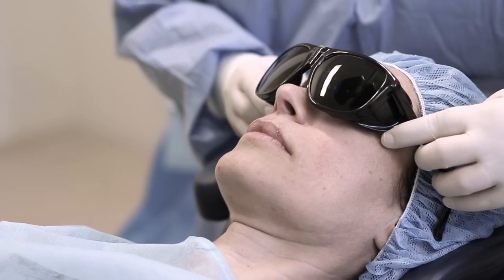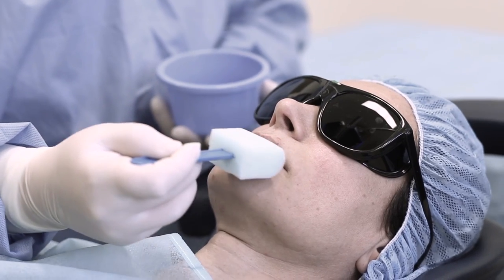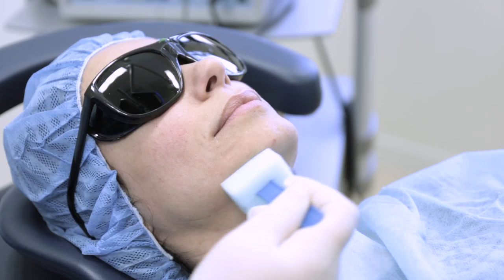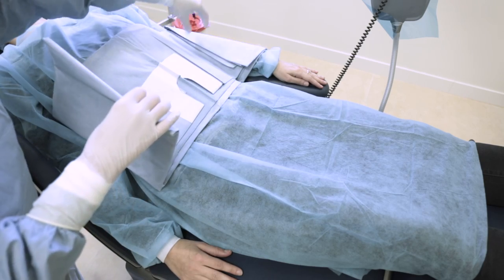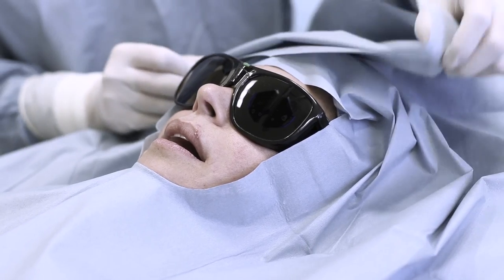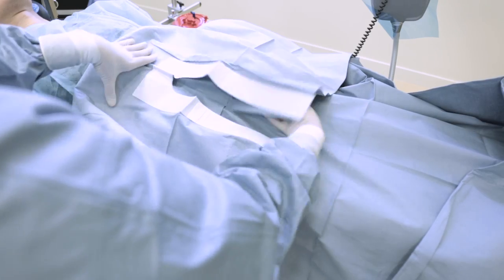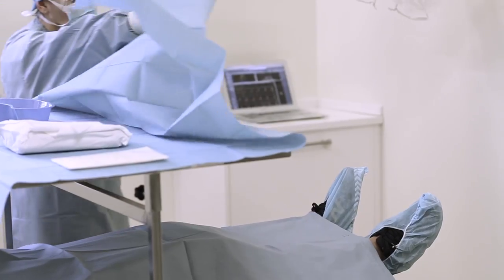The patient's eyes are protected with goggles and their face is disinfected with specific products, using a circular motion starting from the lips outwards towards the edge of the face. At this point, the drape is placed over the patient's chest and fixed under the lip to create a wide and safe sterile field. On the drape, there is a label indicating how it should be unfolded. This procedure can be completed by a single operator.